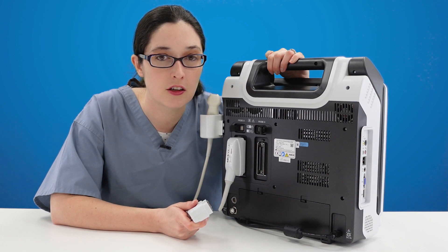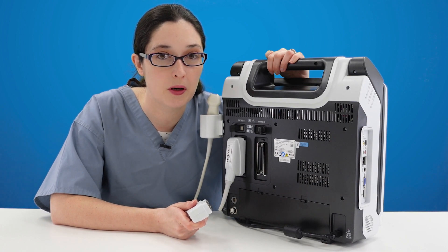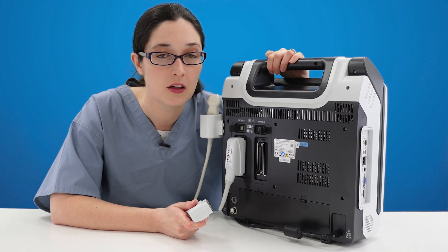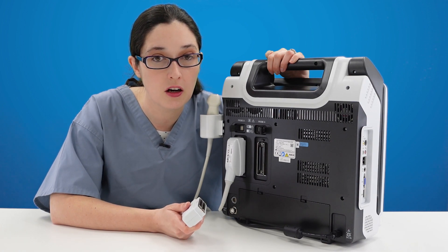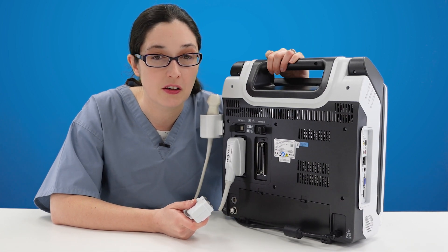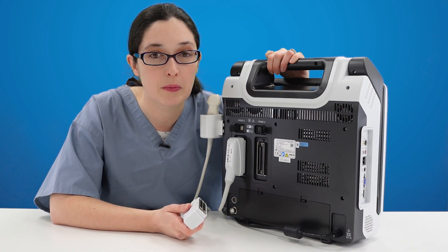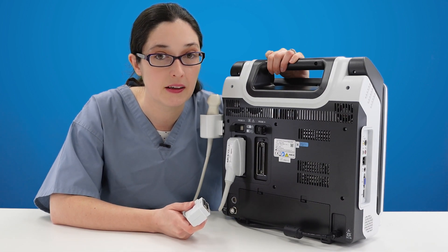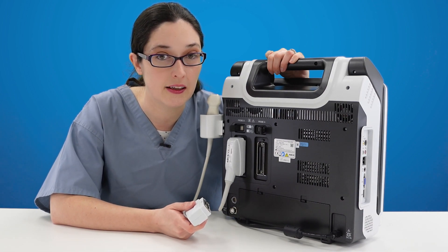The Apogee 2300 has two probe ports so you can have your cardiac and abdominal or your micro convex and linear probes plugged in simultaneously.